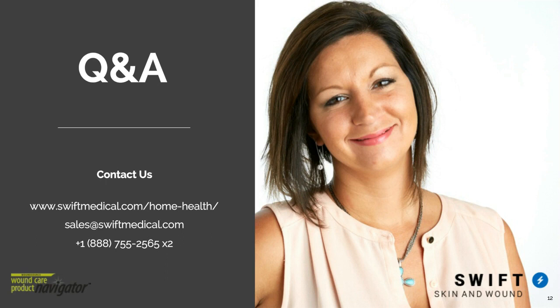Does the distance of the camera from the Helix make a difference in measurements? When our team comes out and educates your staff on using it, we have an optimal distance that we suggest when using it. So we tell roughly 12 inches, or as I teach the nurses, like your elbow to your wrist is the ideal location, and then you would zoom in to capture the wound in that box. But the point of the Helix is to capture the consistent measurement.